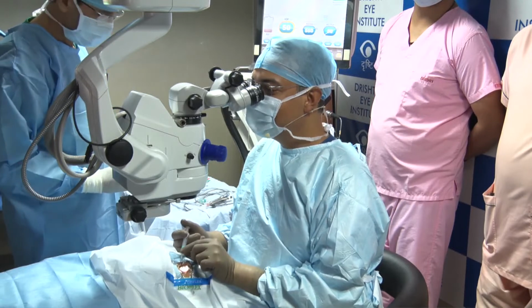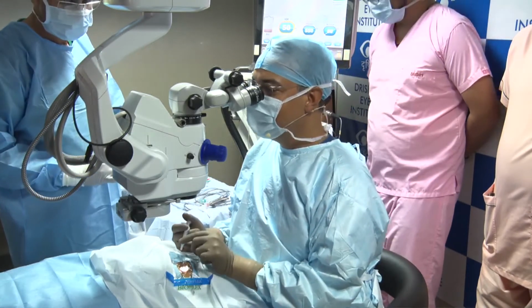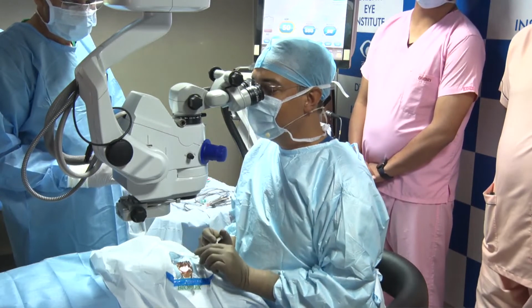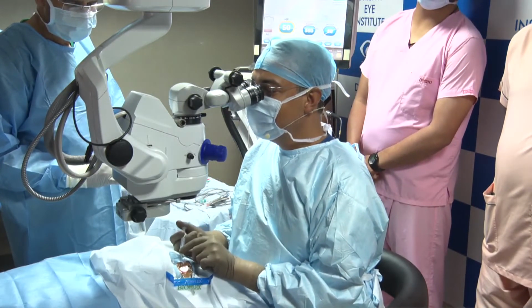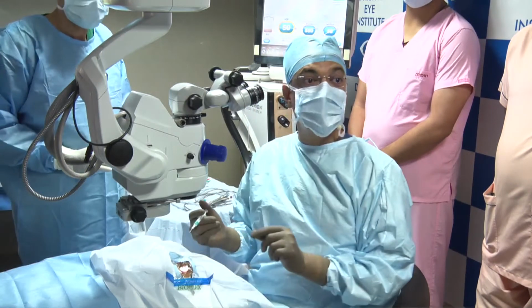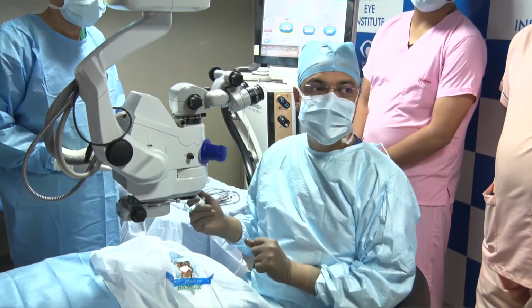What is the maximum power you have used IPCL, Dr. Gaurav? Sir, I have only used a customized one up till about 23 or 24, but some people have, I think, used much higher than that. I have done quite a few bioptics for patients with 30 diopters, where we put an ICL of around 20 and did about 7 or 8 diopters of correction on the cornea. But customized ones, I think, are available. I don't know the exact range. Maybe somebody else who uses IPCL will tell us. Right. Till what power is IPCL available? Minus 30, he says.